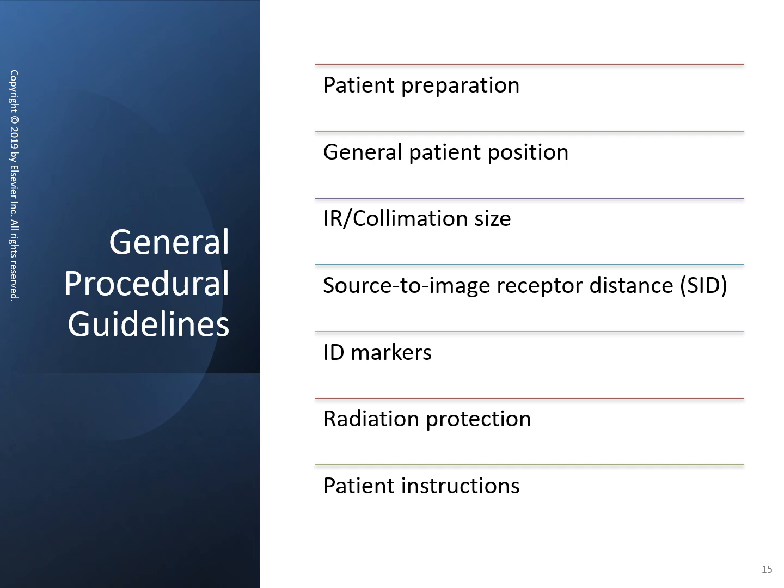Upper ribs are always deep inspiration and hold. Lower ribs are always expiration and hold. The sternum has a variety of breathing instructions. It's deep inspiration on the lateral, but it could be a breathing technique or expiration and hold for the PA oblique and the sternoclavicular joints.